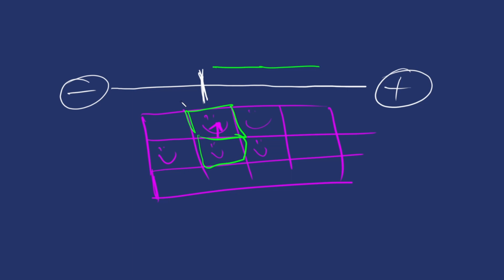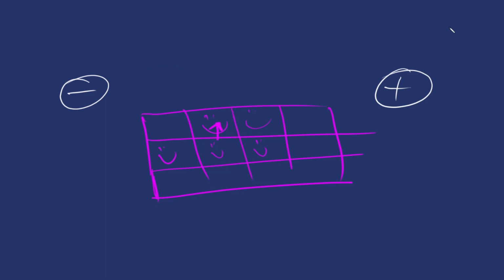If it were to go, say, downwards, right, it would be the same thing. Because there's no left to right movement along this plane here, we would still have a negative, or no amplitude or anything whatsoever. There would be no signal. But obviously that's not exactly what happens.